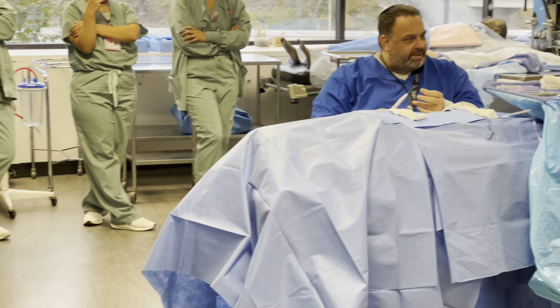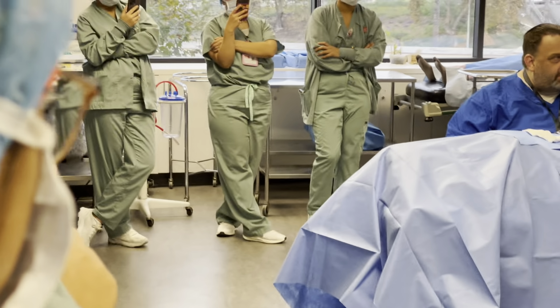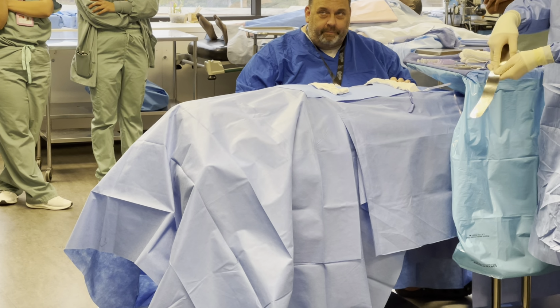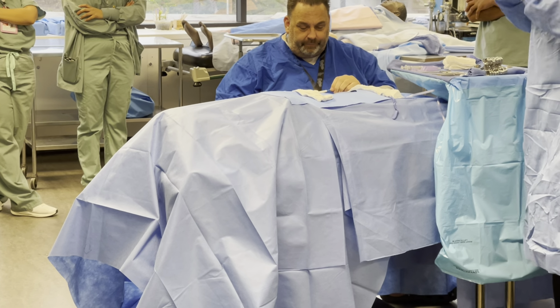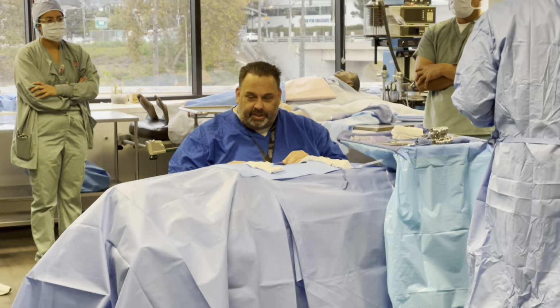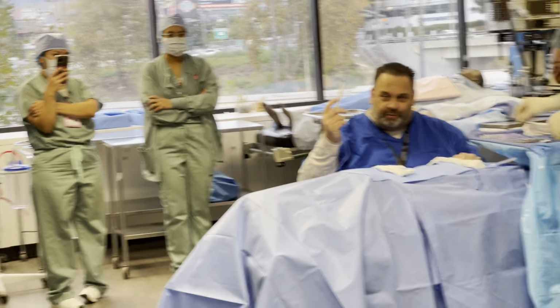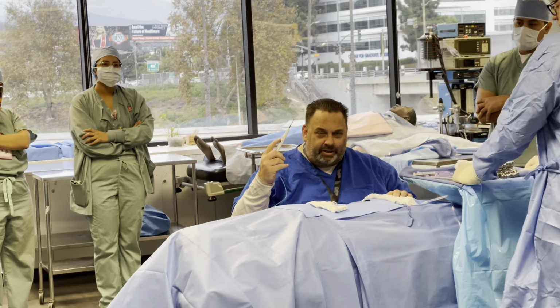That's how you want it on the way. Just so you guys get an idea, he's talking about it going this way rather than this way. So you gotta turn that around so it cuts like a knife if it's wrong. It also has 2 buttons, a blue and a yellow. Blue is for coag, yellow is for cut.